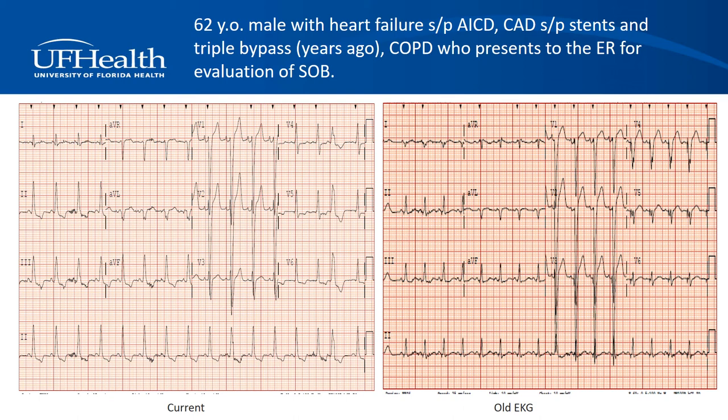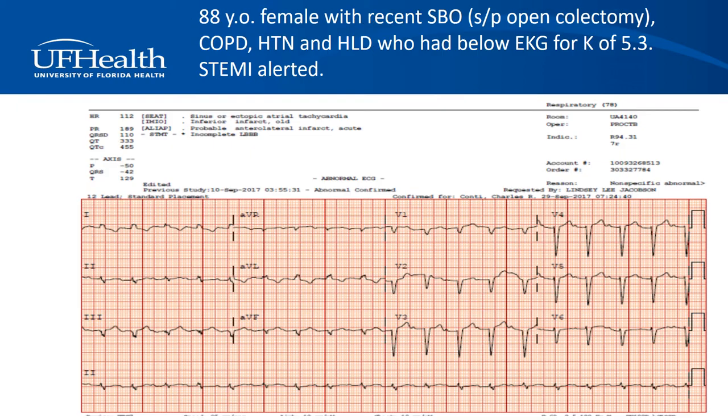Here's an old comparison EKG for this patient. As you can see, the ST segment changes appear unchanged overall. The patient was diagnosed with a COPD exacerbation and the STEMI alert was canceled.